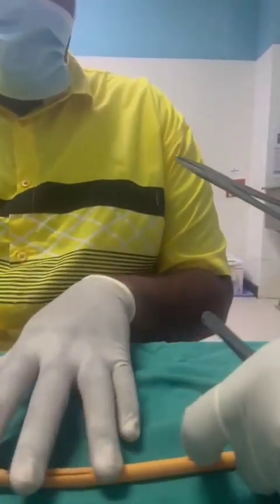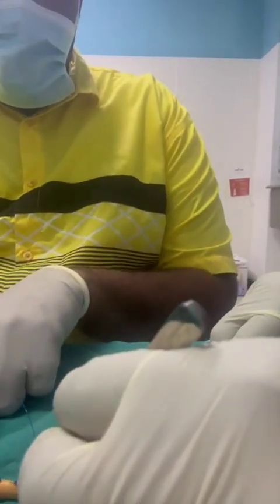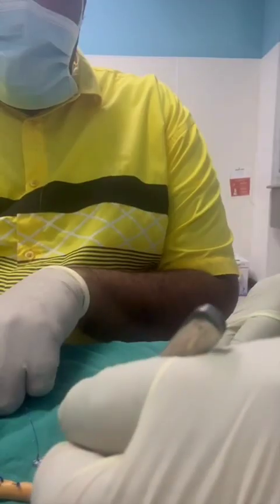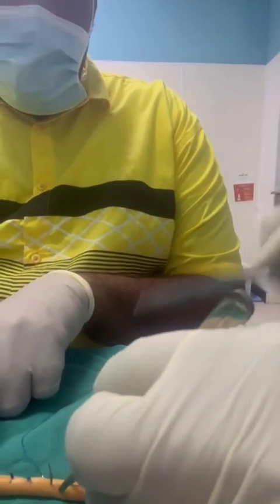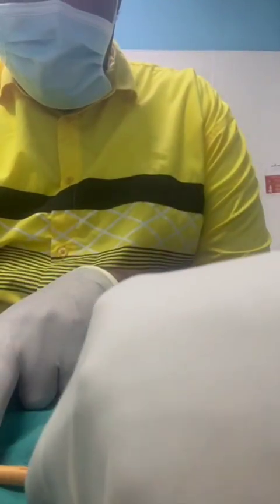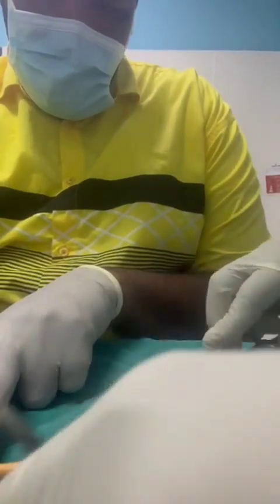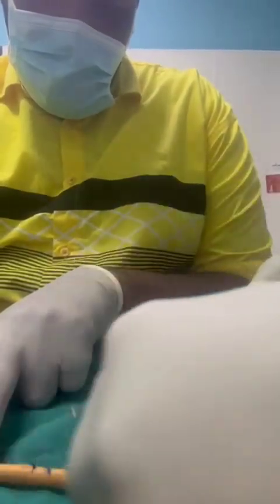Now the continuous suture, where after I make the first knot, the surgeon's knot again, 1, 2, then we do not cut after each knot.